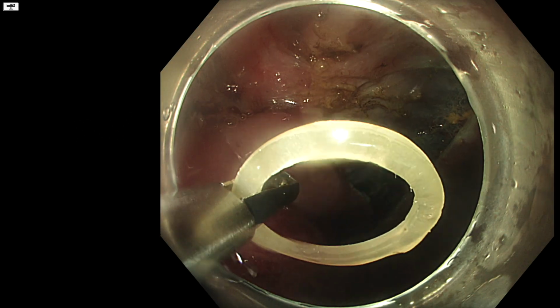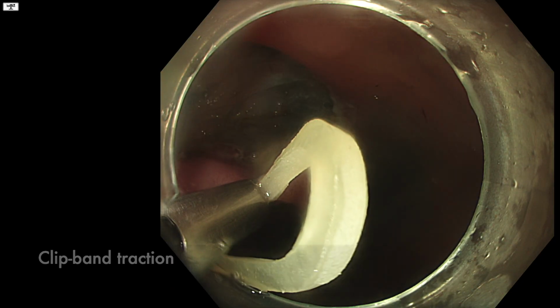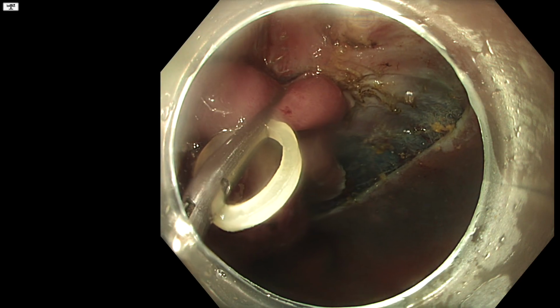So again, progress is slowing down, so we decide to switch our strategy once again, and this time we've decided to place a clip band traction.